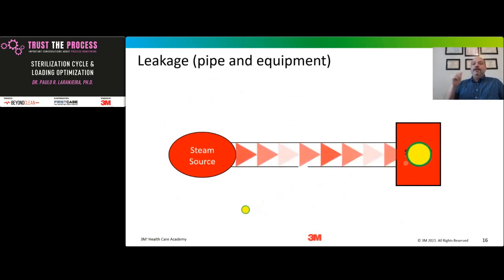The equipment doesn't see that because the temperature sensor is on the drain. This is going to be in the coldest spot inside of your sterilizer, for instance, on your non-metallic devices. Your pressure sensor is not going to measure it because of Dalton's law, because the pressure is the sum of the pressure of the non-condensable gas plus the steam. So the pressure is going to be the same. There is no way you can detect that non-condensable gas that is going inside of the chamber. That's why you cannot use your sterilizer if you have water underneath your sterilizer.